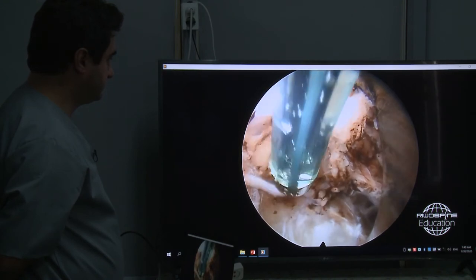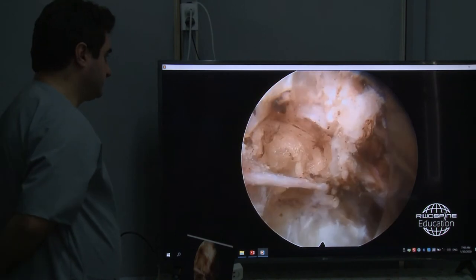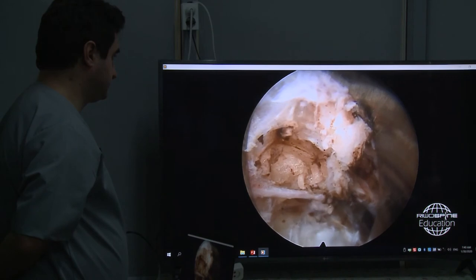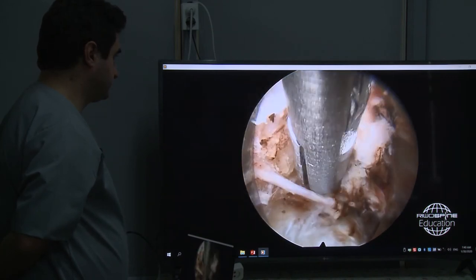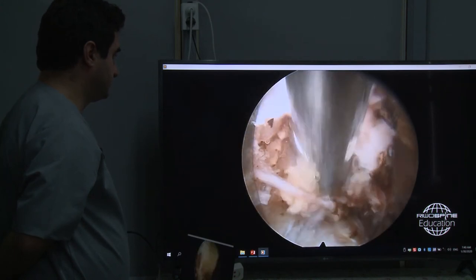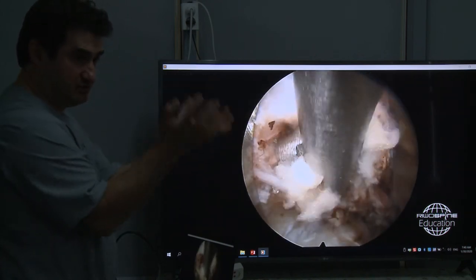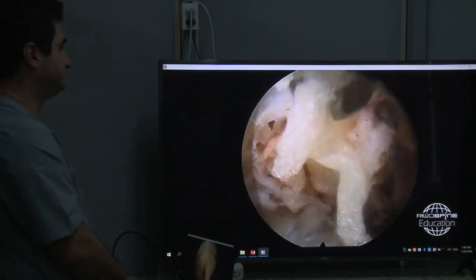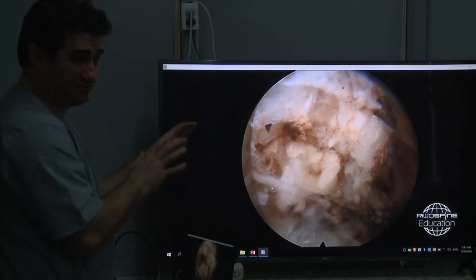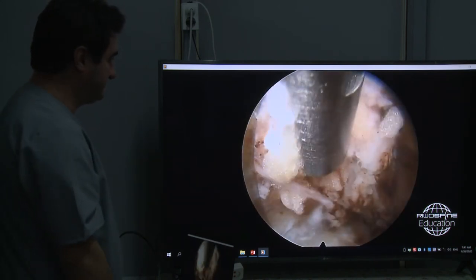Now be careful, sometimes you have really small arteries here that may bleed. So now I have to fix the whole system with my left hand, to make sure that I don't slip. This is fat tissue around the root, cranial aspect. Usually it's not very good to dissect that. It's good protection, yeah, but just to demonstrate.